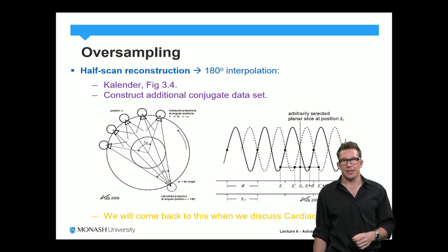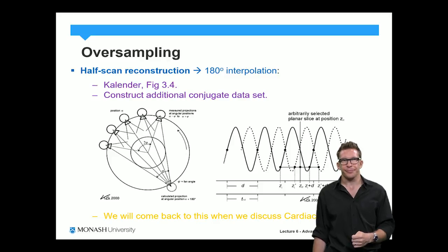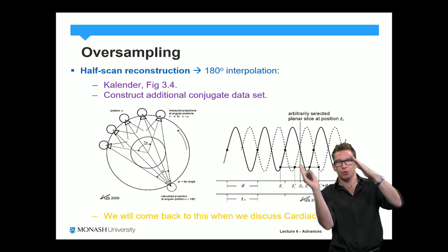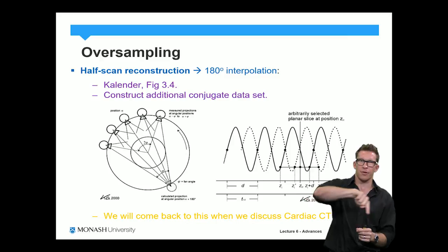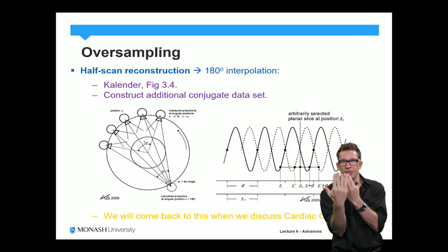Here we can see the result of that synthetic generation process called the half-scan reconstruction. On the left-hand side, we can see that as I rotate round, before we said in our interpolation algorithm, in our tilted sinograms, the 2 tilted lines are 1 pitch apart. Which means, so I was at 0 degrees when the scanner started, I rotate all the way around the 360 degrees, and then I'm back to where I started, which means I can interpolate between those 2 points.